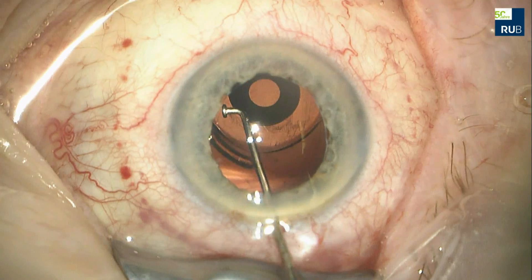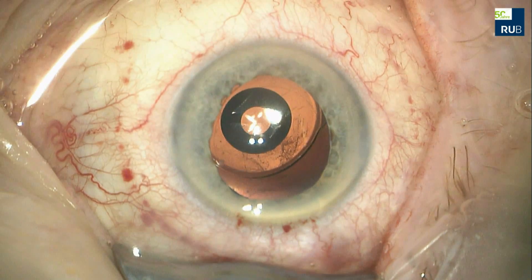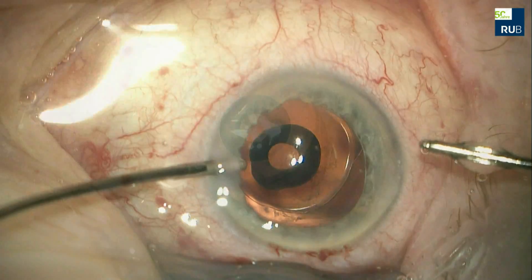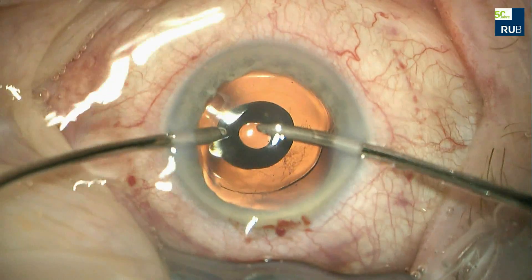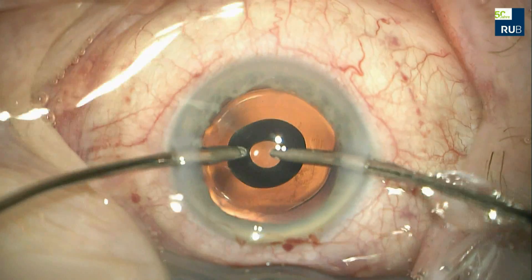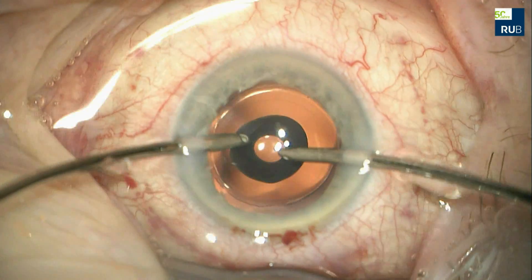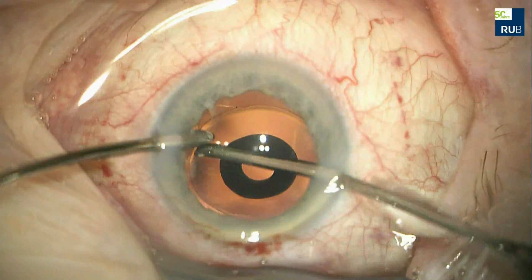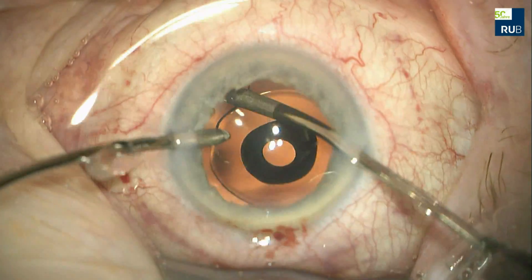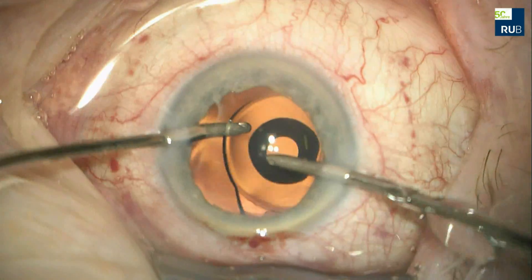The IOL is now being dialed into the capsule bag and positioned in the 12-6 orientation. The remaining viscoelastic is aspirated, going underneath the IOL to remove any residual viscoelastic.